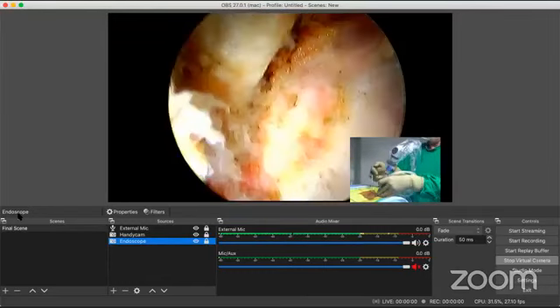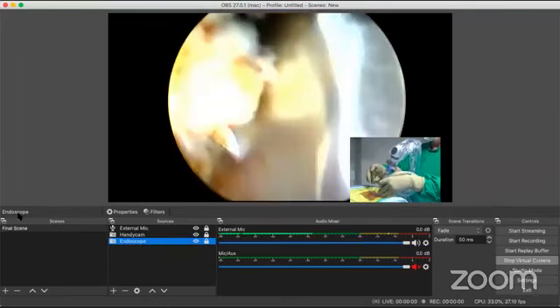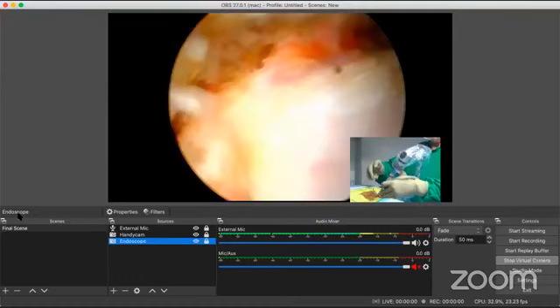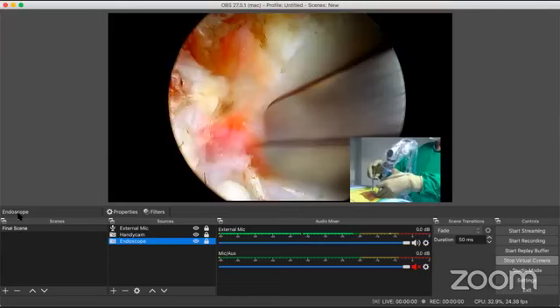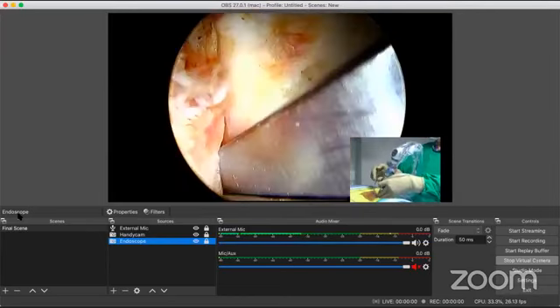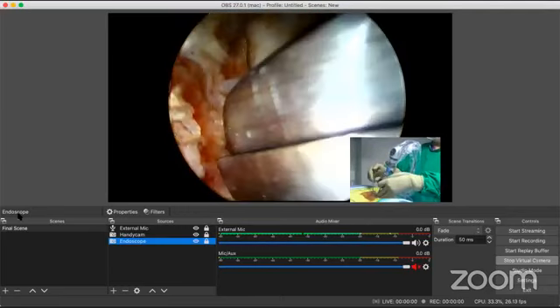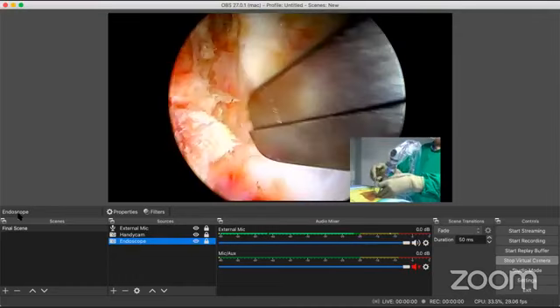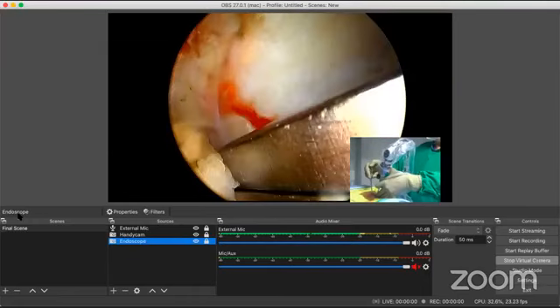And as we go, we'll do a little more stripping here, and push back these tissues a bit so that we have a little better vision as far as coming laterally is concerned. Now laterally, as I come down, you see, this is my V point. I need to strip a little tissue here, okay? And from here now my facet joint starts.